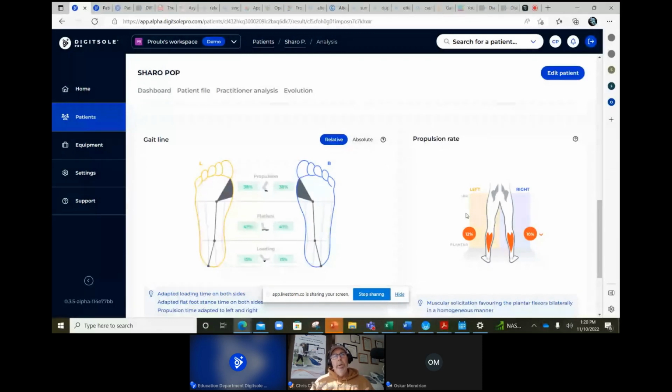And one would think, someone who's pretty active should have good core stability and good core strength of the musculature in her torso. And so, at least at this speed, it's saying she doesn't seem to be using her hip flexors a whole lot. So she's using this plantar flexor strategy. So people that have that lower core stability tend to use that sort of strategy.